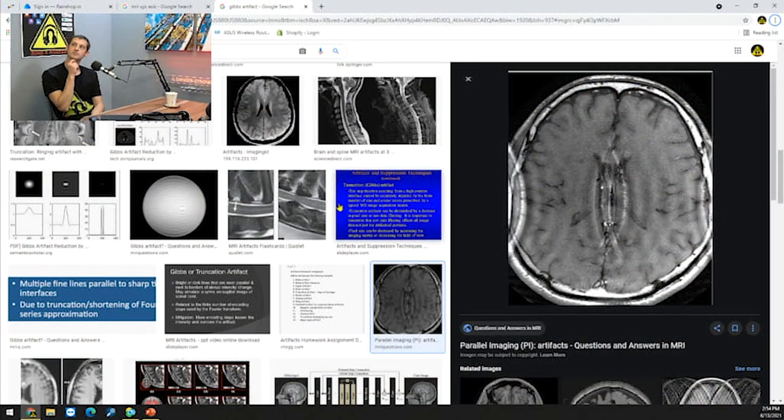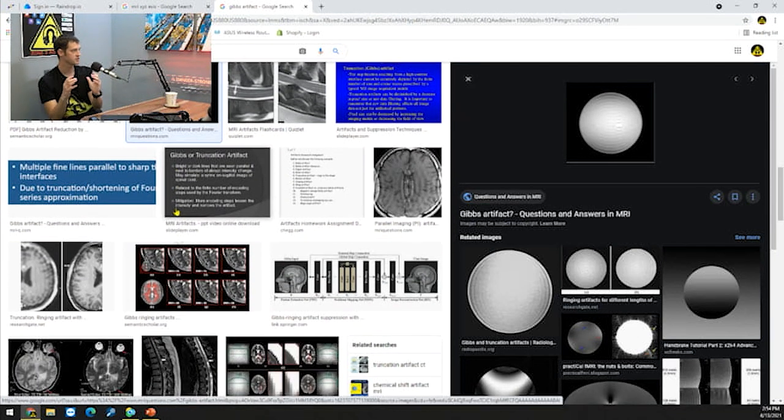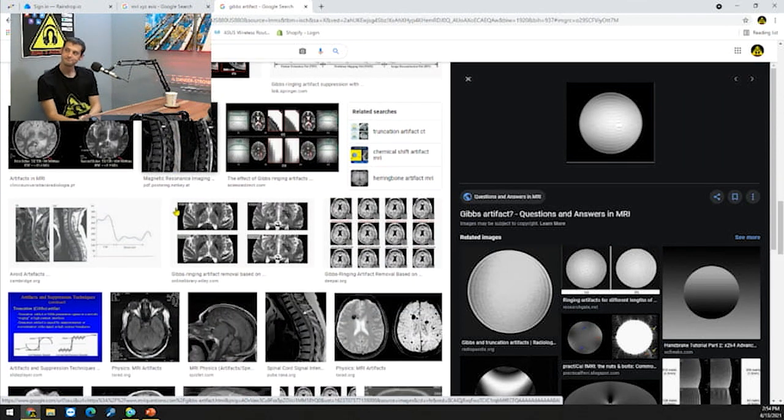Or go to the left, there's a circle with those wobbles. That's an example. It's not the best example because it's not a head or something, but the edges are easy to see on the circle, and they're wobbling. That's from not having enough Kspace samples to perfectly realize that edge. If you did more and more, it gets a better and better approximation of what's going on there. I see.